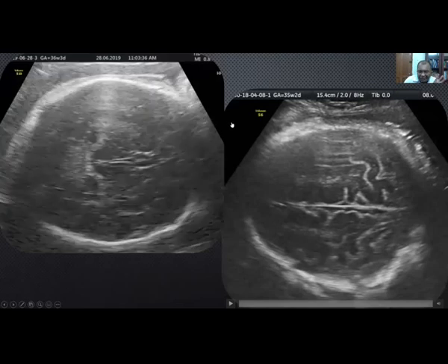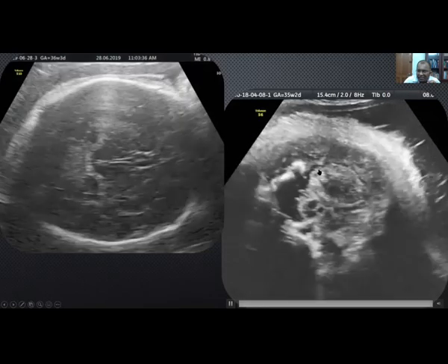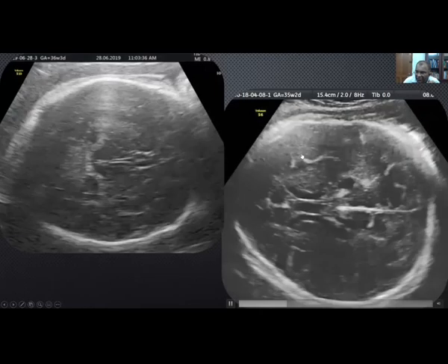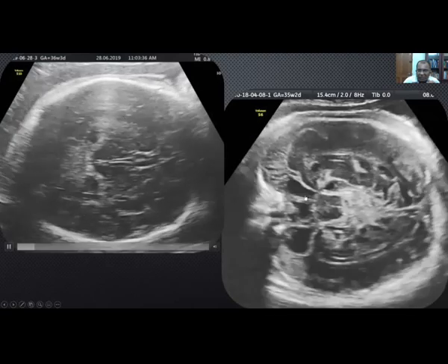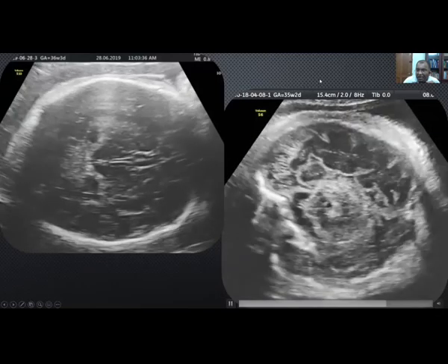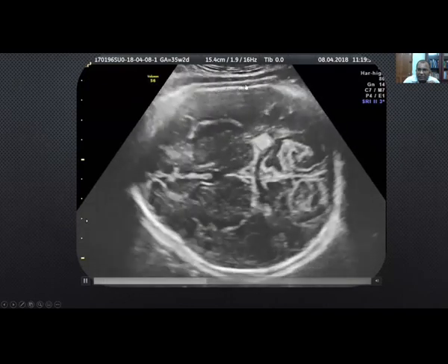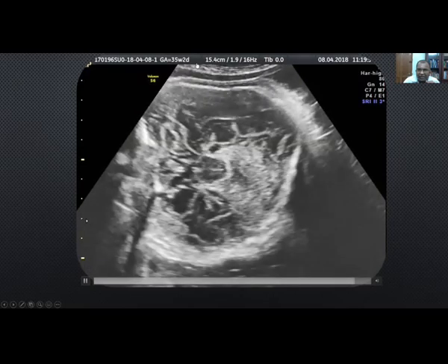Once you are through with the shape of the skull and the calvarium, you need to look at it further. Now, if you are seeing too much of the brain in the near field, that is not a good sign. This is how a normal 36-week skull looks. Seeing too much brain at 36 weeks is not a good sign. You need to look for brain or calvarial mineralization abnormalities. You need to do the ping pong test. Apply mild pressure on the probe and see the flattening of the skull bones at 36 weeks.